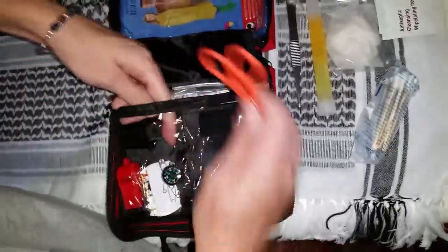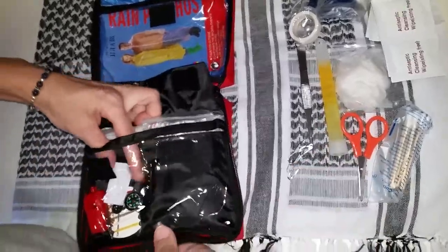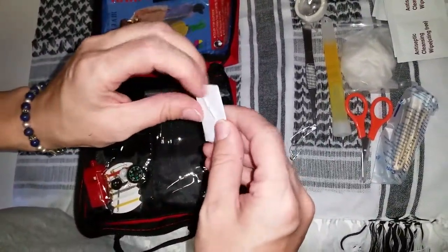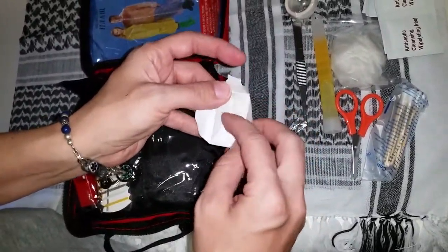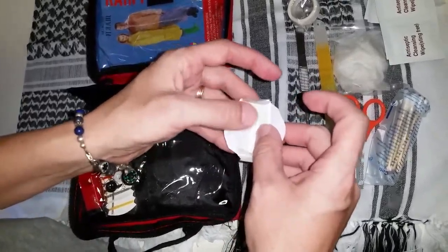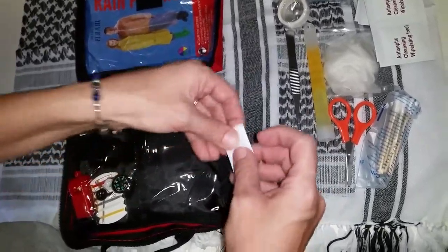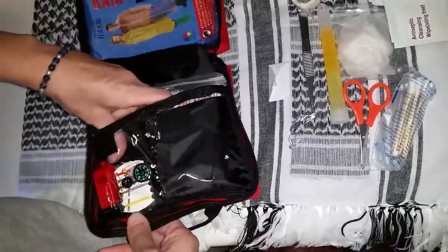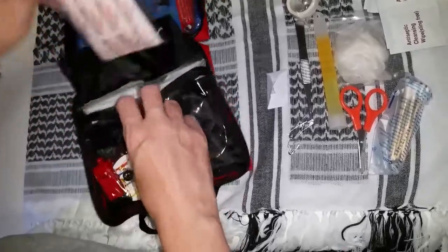Scissors. Safety pins. Let's unfold that and see what it is — razor blade, that's why that's all wrapped up. It looks like a little sewing kit. And a whistle — just as my kids would tell you, I always have them carry a whistle around.